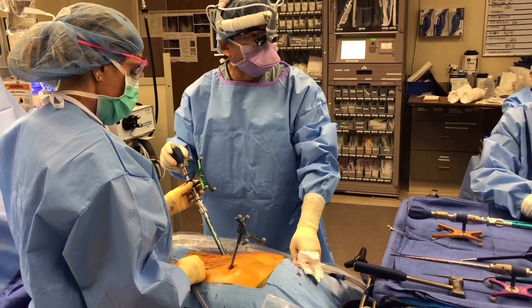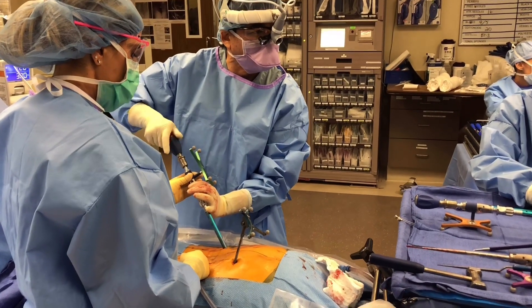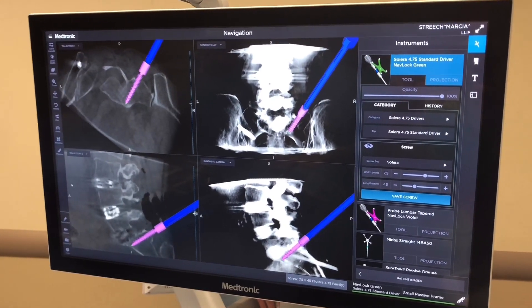I'm putting in the screws now. Everything is going really well so far. I'm using navigation to make sure that this goes in perfectly. It's cheating, but like my mama always said, if you don't cheat every once in a while, you ain't tried hard enough.